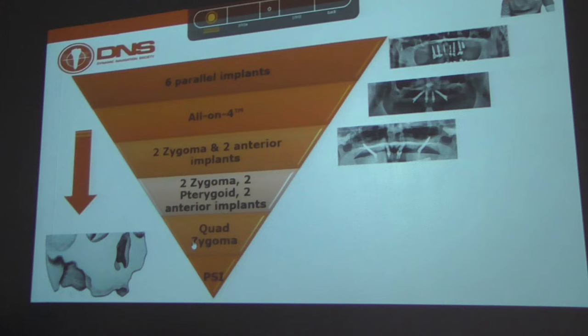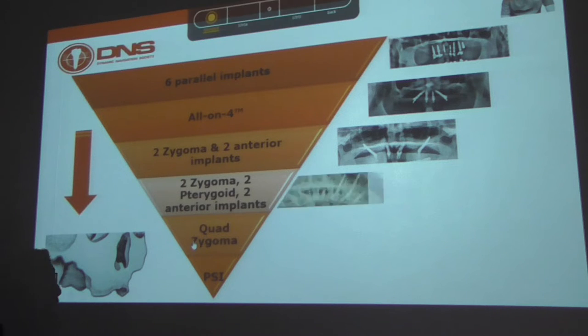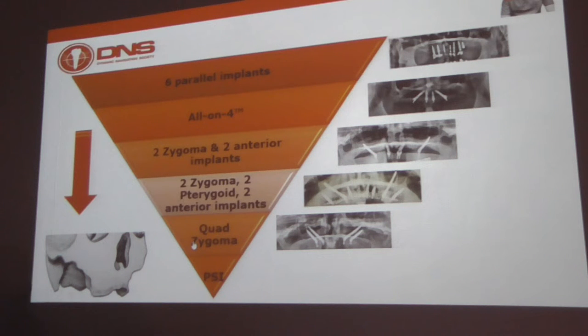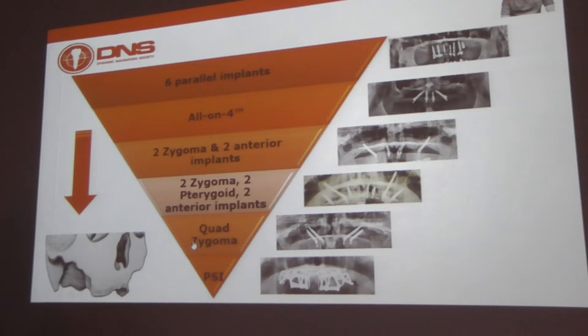If it is more atrophic, then I would go for zygomatic implants in the maxilla and all on four in the lower. If the anterior implants are only one possible or really weak, or the opposing dentition is natural, then I will have to go for pterygoid implants. If absolutely atrophic, or post onco resection, post mucor resection, then I would go for a quad zygoma. And if nothing works, then finally subperiosteal or patient-specific implants. So this is my tree of how I would decide which treatment to do.